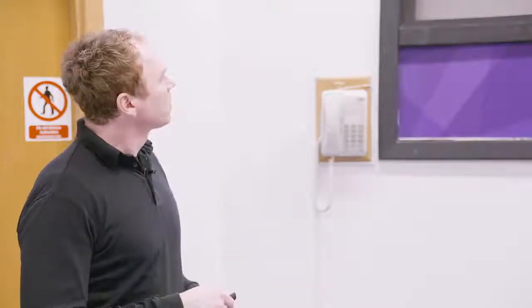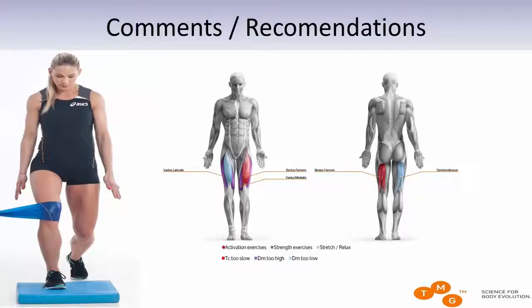So this is what I was talking about. This would be the summary of everything. You get the list of all the muscles that were measured, in this case only 5 of them around the knee joint. If some of the muscles need additional attention or intervention, they will have a color displayed here.